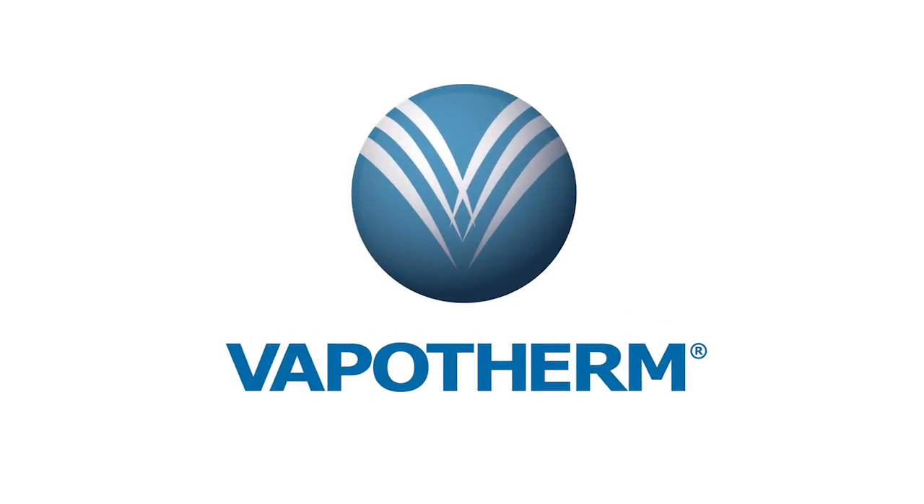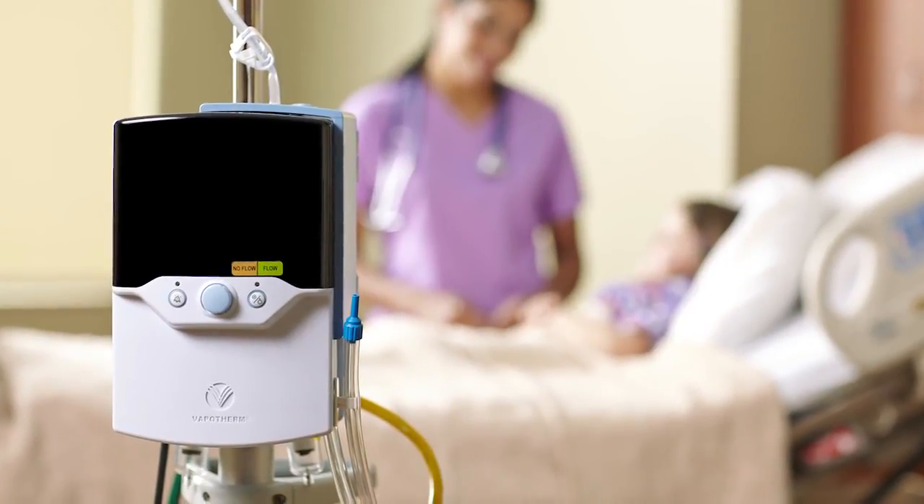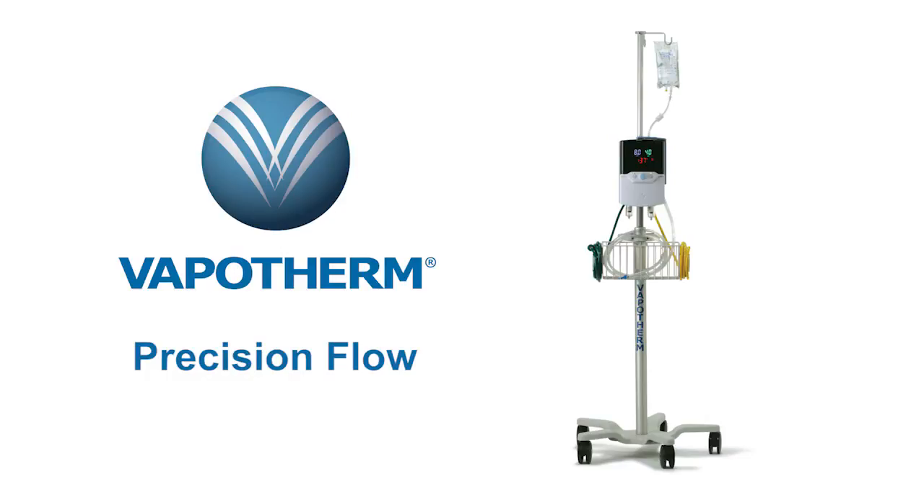The Vapotherm Precision Flow provides small-prong high-flow therapy support for patients in respiratory distress. This video will detail how to set up, use, and clean the Precision Flow device.